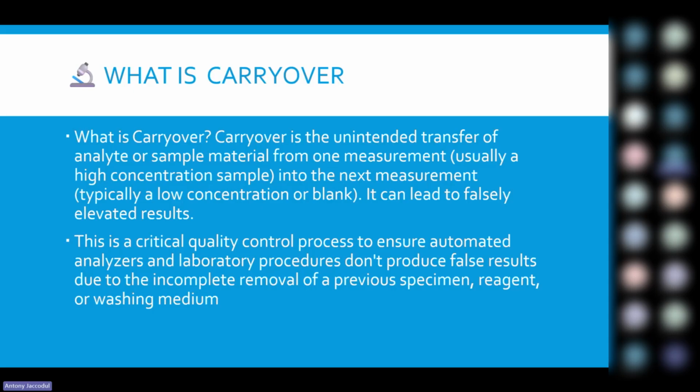Remember, carryover can also result from carrying over washing media to the sample, or carrying over leftover results from the previous sample, causing unintended, falsely elevated or false results. It's an important process to ensure that samples of very high clinical significance do not cause panic in the laboratory.